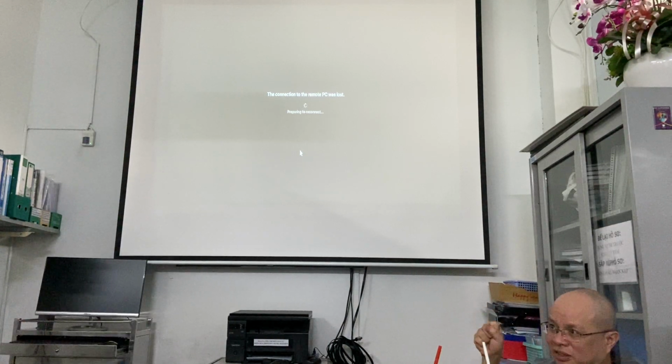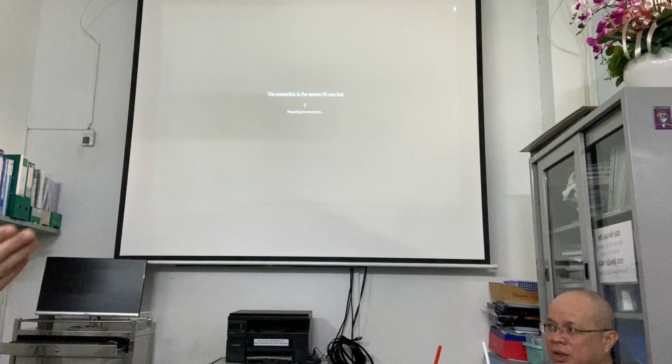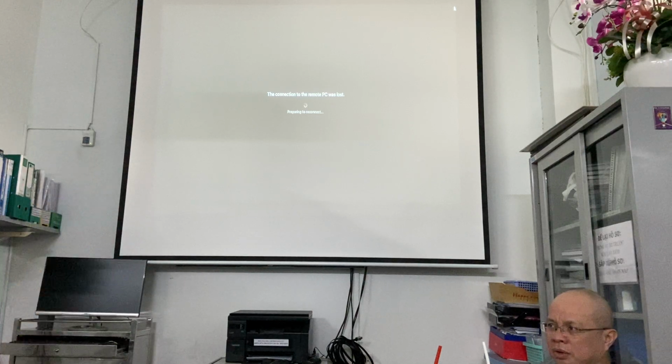Yes, because you can deflect this system. Actually, I saw you did, it looked very easy, and it's not so complicated. It's really easier to capture, because you see it on the echo. So I turn it and then I advance it.